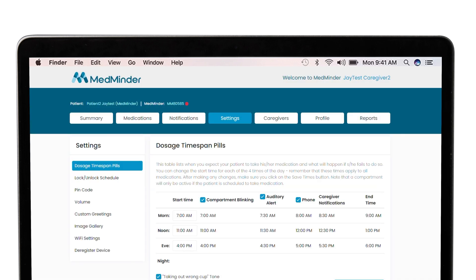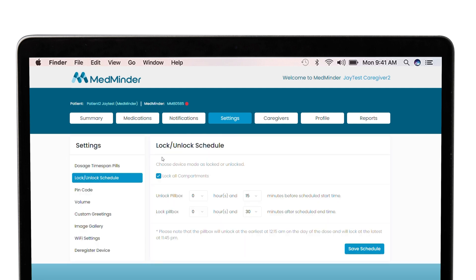Once logged in, click on the Settings tab and navigate to the Lock/Unlock Schedule on the left-hand side. To unlock your MedMinder device, uncheck the Lock All Compartments setting.